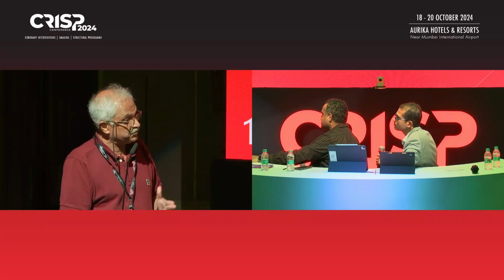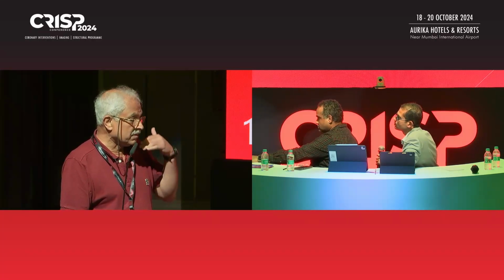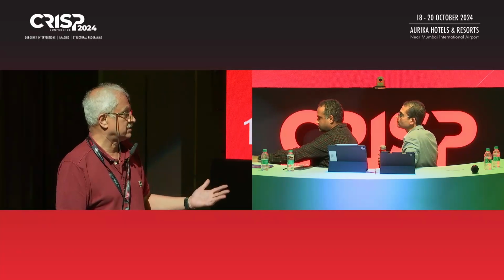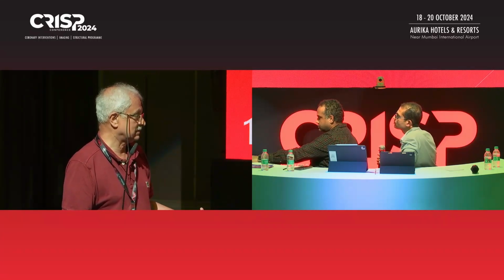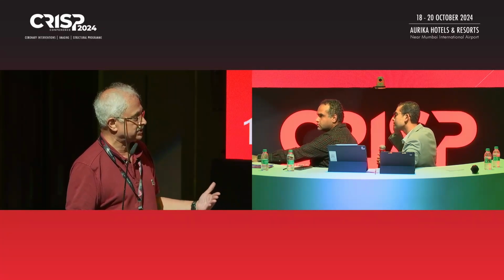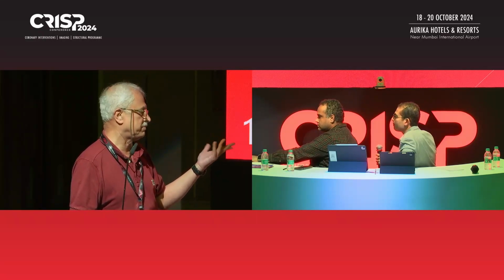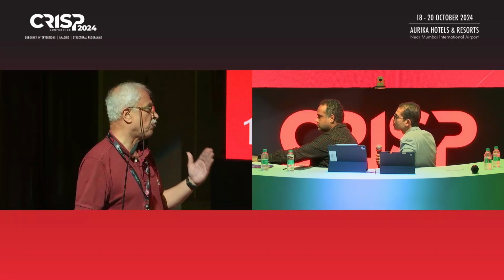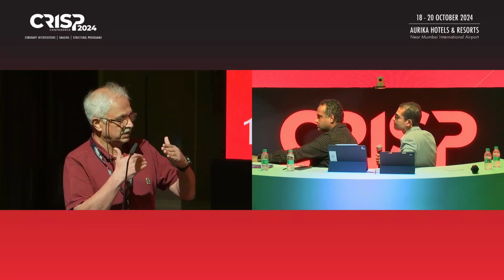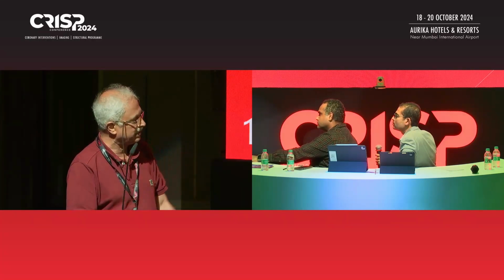And the second thing, which we have not been really looking at very carefully, is malalignment. Of late, our embolizations have been more related to malalignment rather than to the size of the defect or the rim abnormalities. In the last 3 years, I would say we have embolized maybe 5 or 6 cases, out of which 4 or 5 have been related to malalignment. And most of the malalignments have been with septum primum and secundum, beautifully seen on bicaval views.